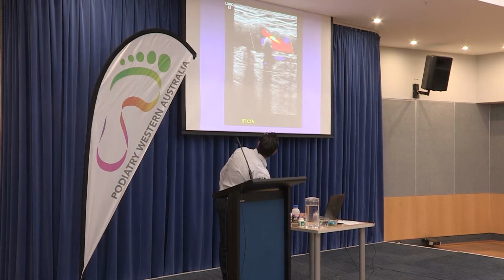So you see this big plaque here, and because the area at that point is narrowed, the whiteness is the velocity. That's a code for velocity as well. I can show you some numerical things as well. But there's obviously an accelerated jet coming off that stenosis. So if you interrogate within that accelerated jet, you'll find a flow acceleration, and from that flow acceleration you can determine how much stenosis there is at that level.